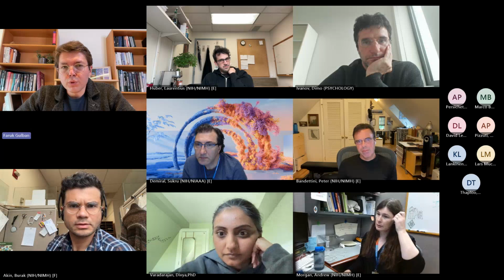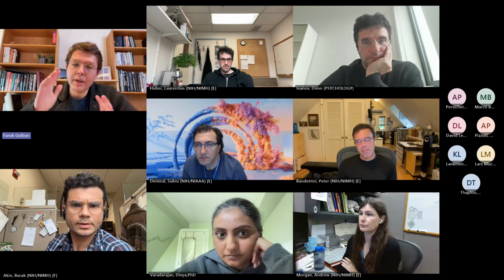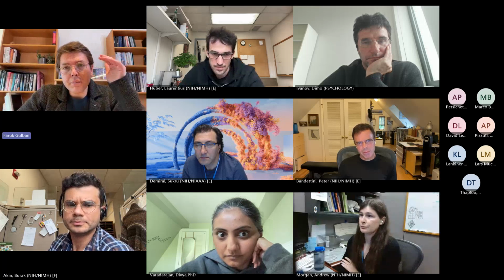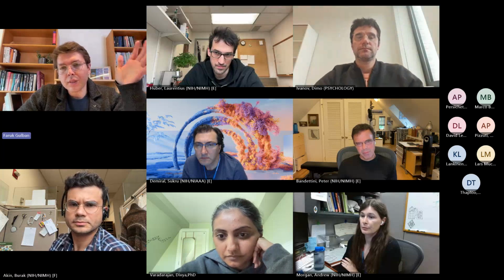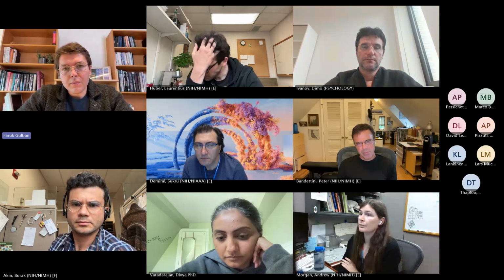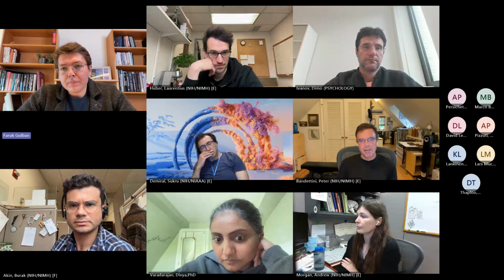Time course, you mean the multi-echo data? Yeah, the time course. Yeah, I don't know which one you refer to, but often I showed just the echo average. But yeah, in the 3D EPI, I have echo times of 10 milliseconds, 24 and 39 milliseconds. In the GRE, I have from 3 milliseconds to 21 milliseconds, like 6 echo times, much more dense. Yeah, that may matter, whether it's motion or just the deoxygenation around it.